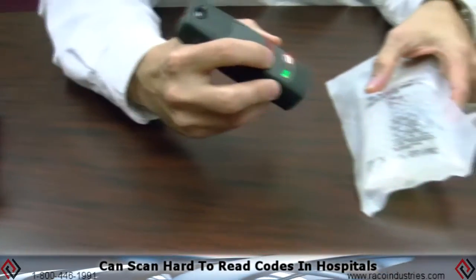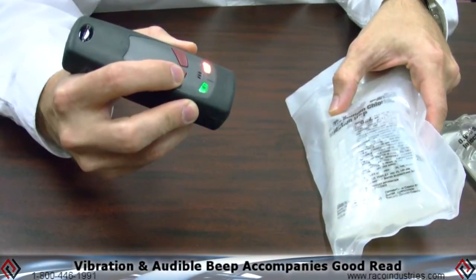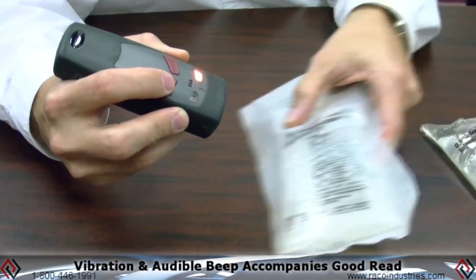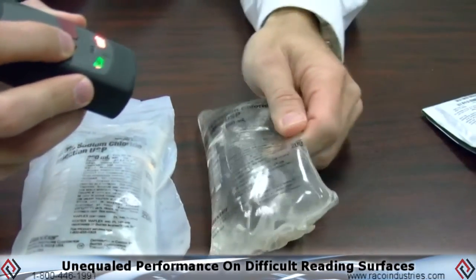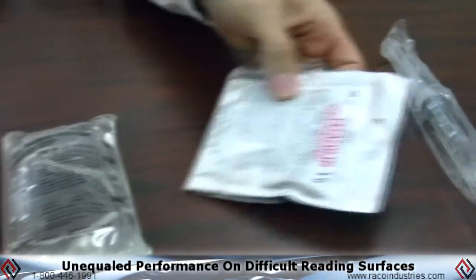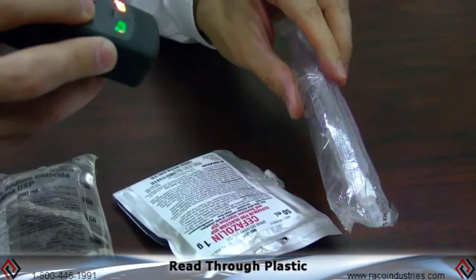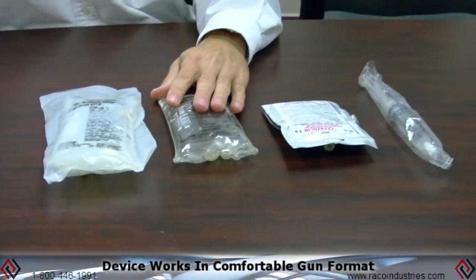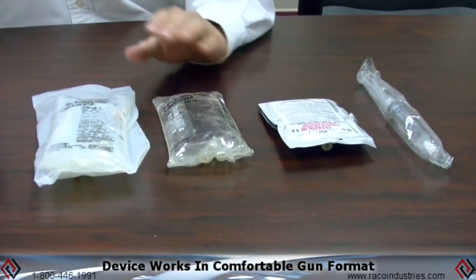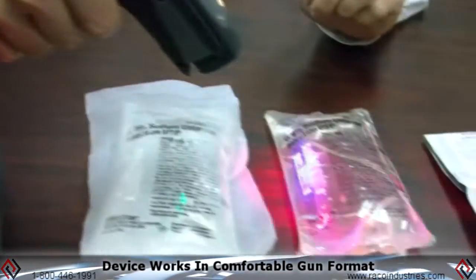With the CR2500 scanner you can read all those hard-to-read codes in hospitals that normally wouldn't scan, with both a vibration and an audible feedback that can be turned on or off depending on your shift. It'll read all the bags, the clear liquids, anything that you thought was the most difficult — any of those hard-to-read codes — and it will read through the plastics, give you that positive feedback, and allow you to do your work that much faster, whether in palm format or with the gun format, whichever is most comfortable for you.